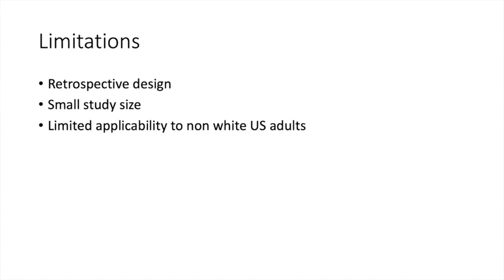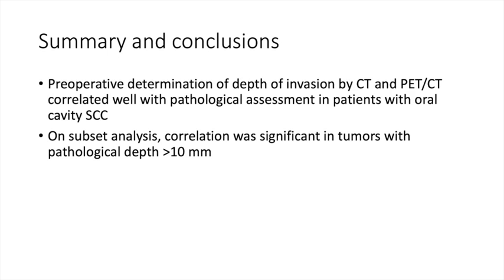Some of the limitations of this study include its retrospective design, small study size, and limited applicability to non-white US adults, given that the study population was overwhelmingly white. In conclusion, preoperative determination of depth of invasion by CT and PET correlated well with pathological assessment in patients with oral cavity squamous cell carcinoma. On subset analysis, correlation was significant in tumors with pathological depth over 10 millimeters.